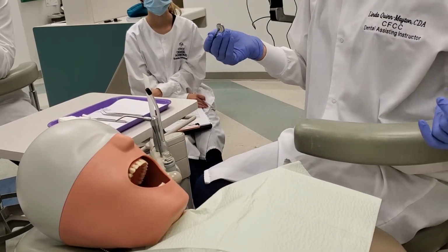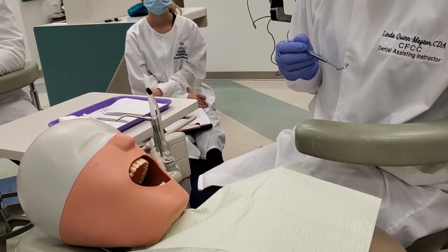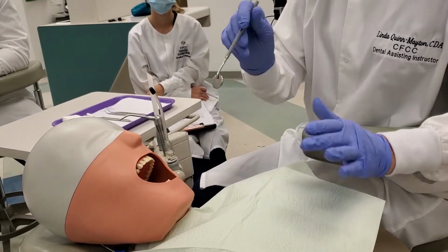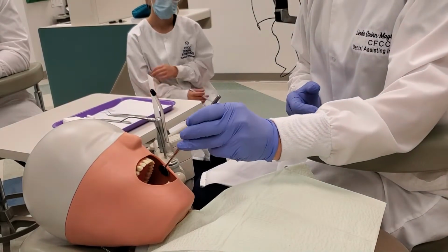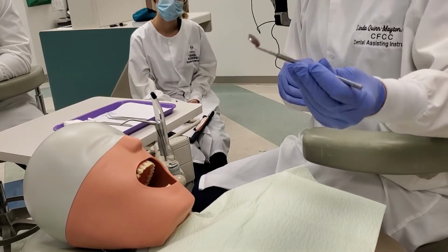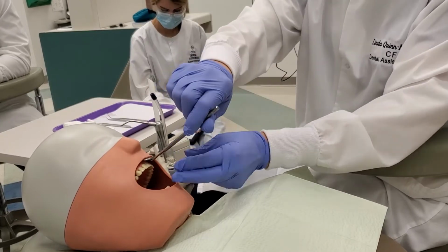The mouth mirror can retract the upper lip, the lower lip, and the tongue. The first thing you're going to do is use the retraction technique for A: use the mouth mirror to retract the upper lip. This is Fletcher, so he is what he is, but on a patient, you don't want to jam it up in there to retract. Always start on the cheek and rub it up against the cheek. That way you'll get a little bit of saliva on the mirror and it'll slide right up in there, and you're not irritating or causing any trauma to the tissue. So get used to coming in like this and retracting.